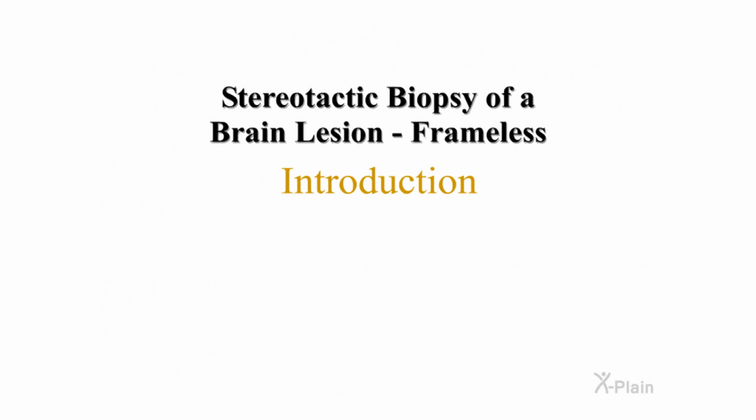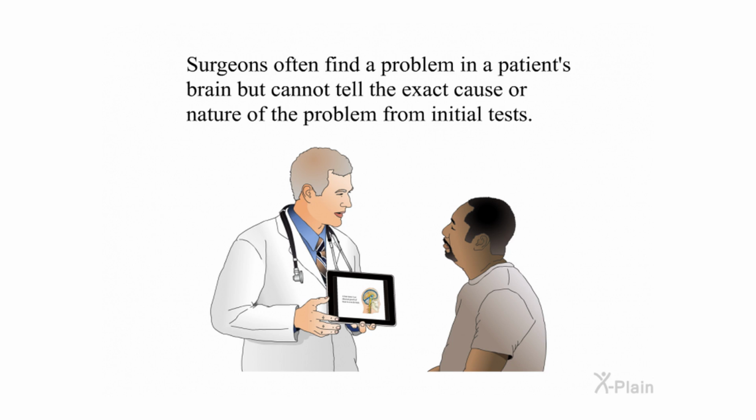Stereotactic biopsy of a brain lesion, frameless introduction. Surgeons often find a problem in a patient's brain but cannot tell the exact cause or nature of the problem from initial tests.